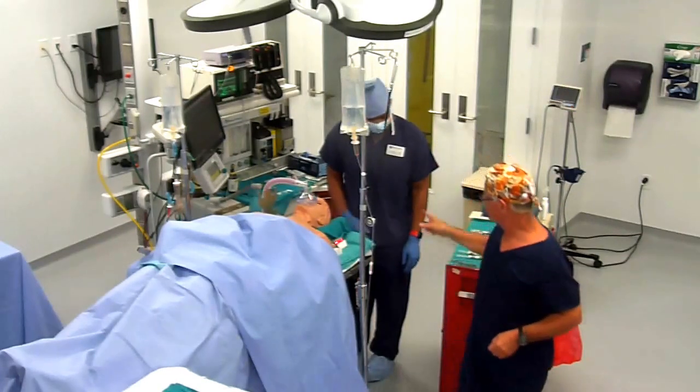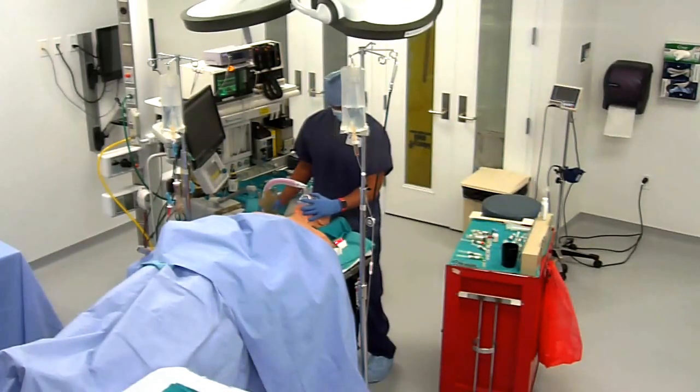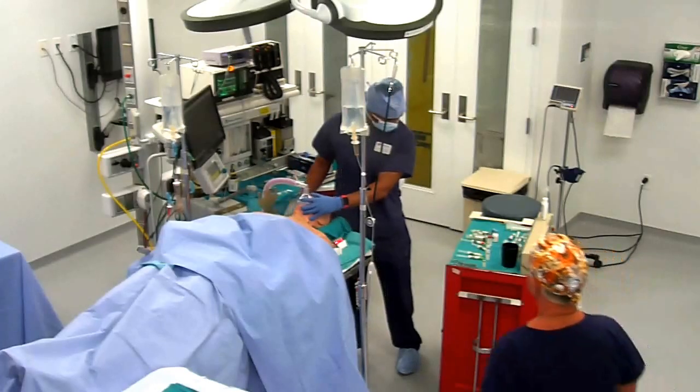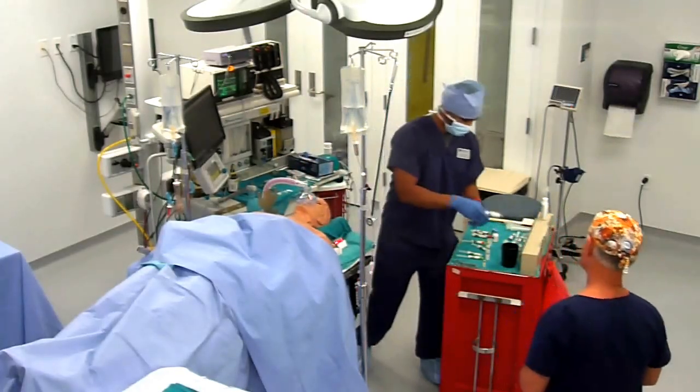Yeah. Go ahead. Okay, she's awake now. So I'm going to give some more propofol. Okay. I'll help you with that. Should have put it out.